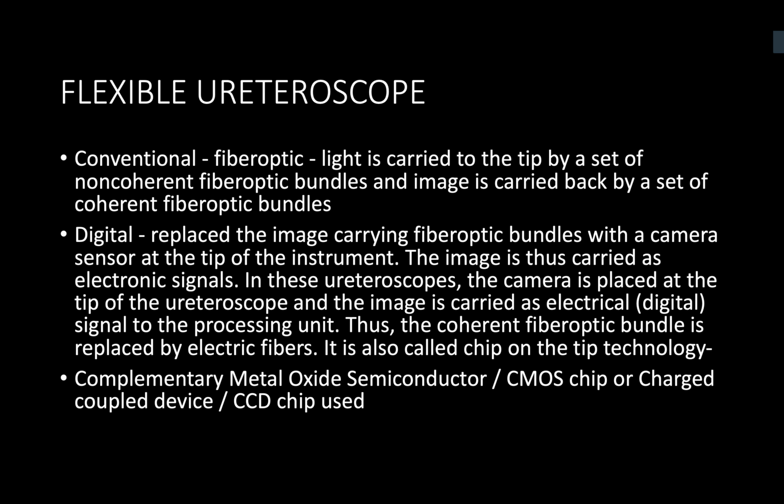Okay. And what are the types of fiber optic bundles used in a ureteroscope? The main type are coherent, so they have the same arrangement at both proximal and distal ends to reproduce the image quality that's received at the tip.